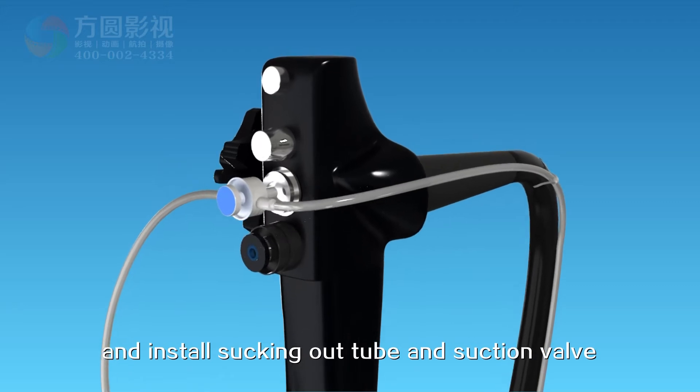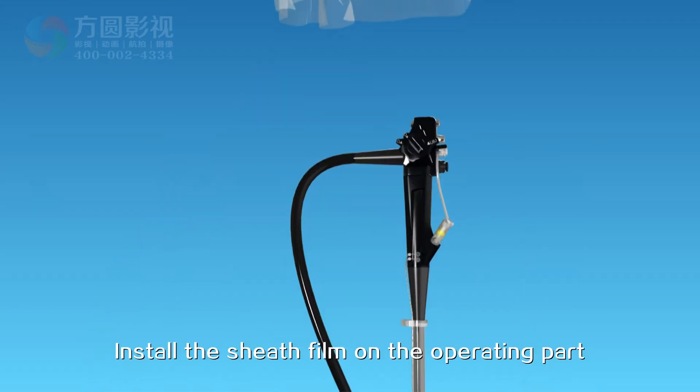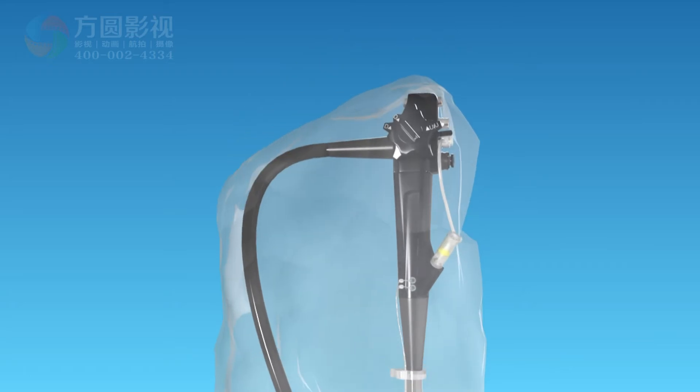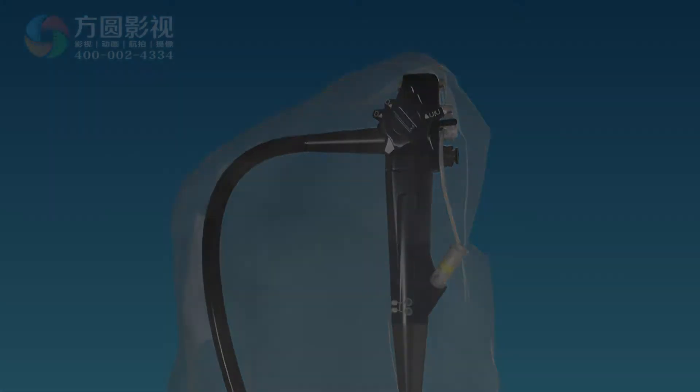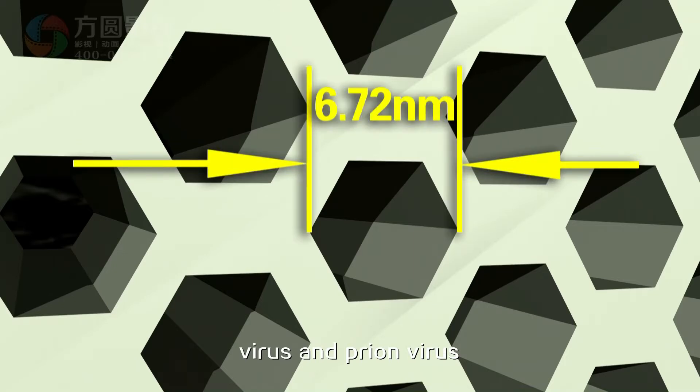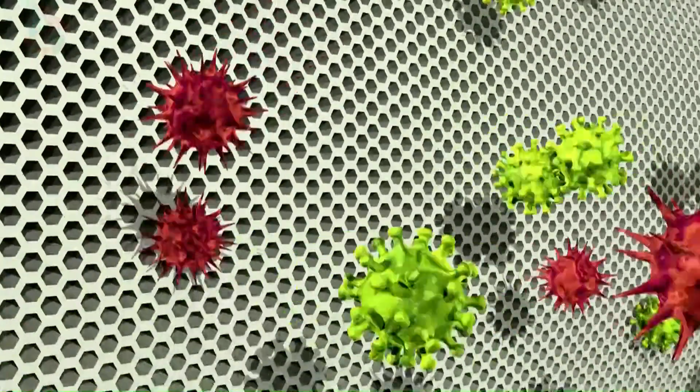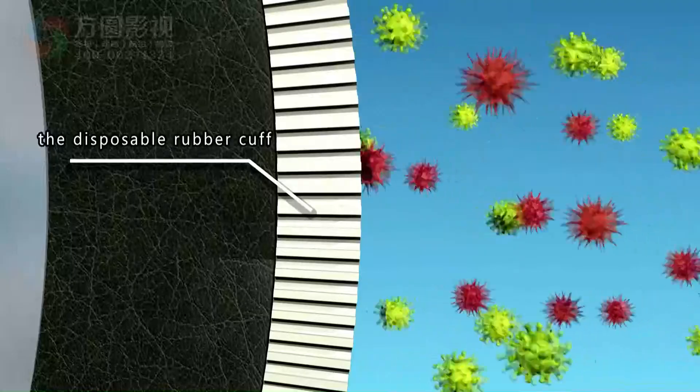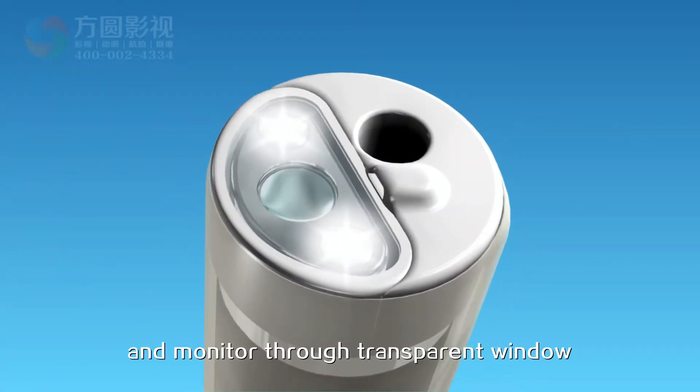Install the sucking out tube and suction valve. Install the sheath film on the operating part of the lens body. The disposable rubber cuff can separate various bacteria, viruses, and prion virus, and the endoscopy can have light and monitor through the transparent window.